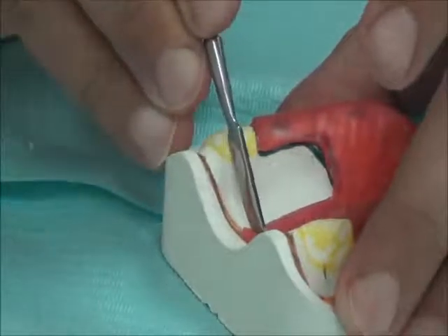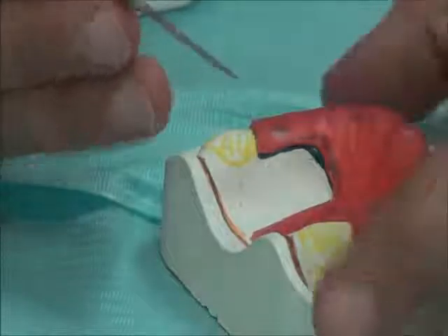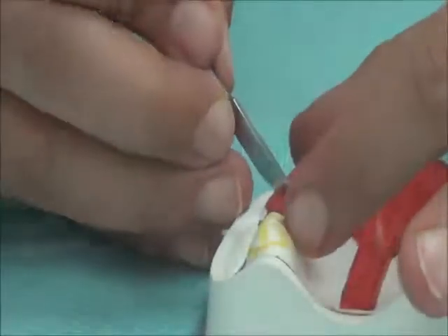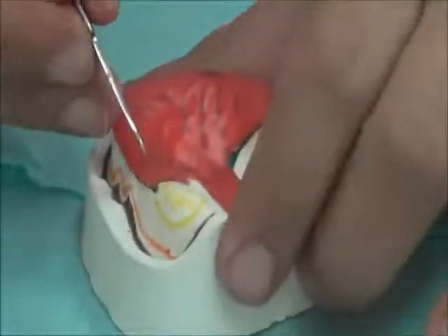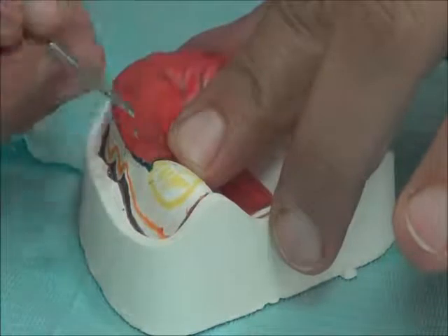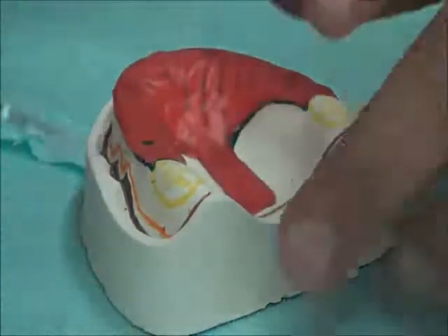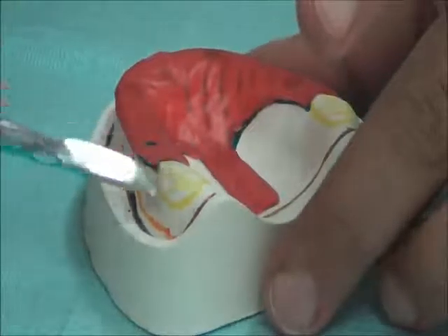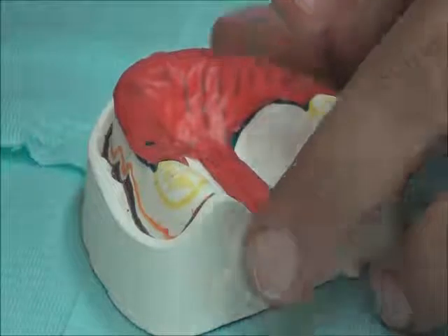A bit short from the border area, just a bit short. Then I'm opening the boxes, so emptying a square shape over the crest of the ridge in the molar area and one in the canine area. So that tray material, as it's touching the support areas, it will touch just over here to maintain the space.